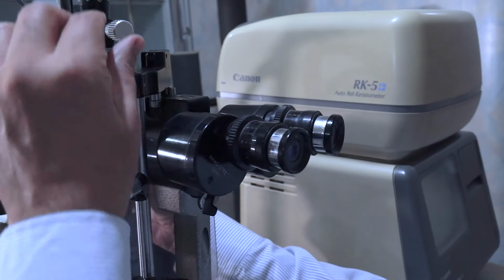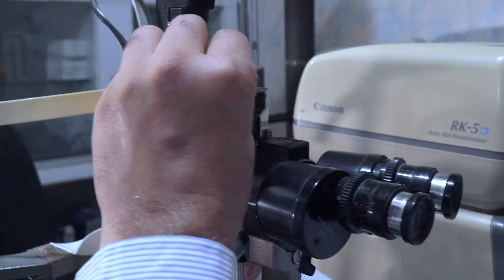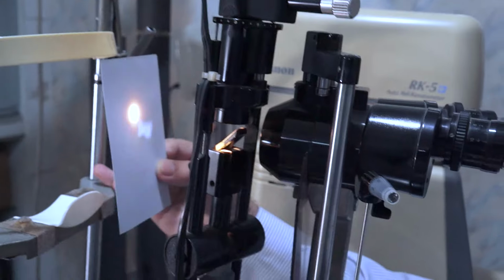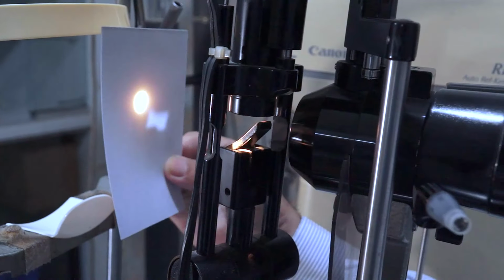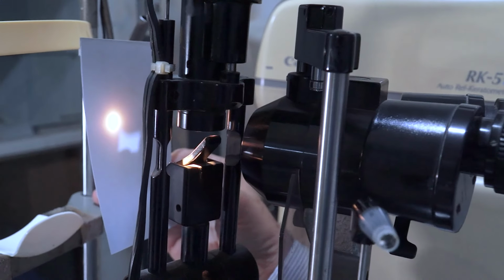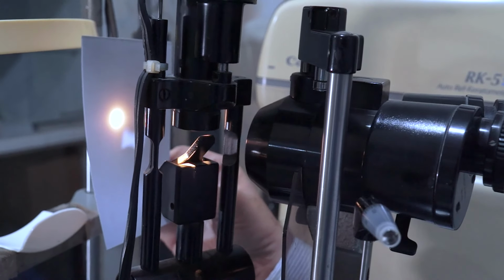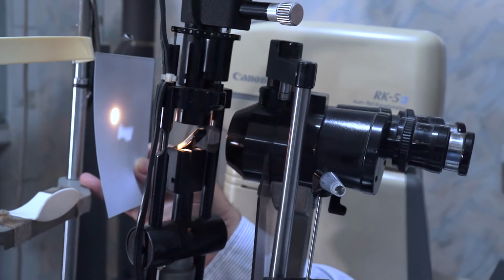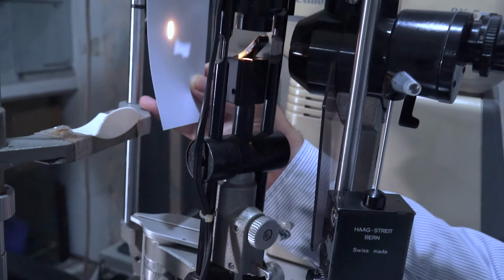This is called a slit lamp because this is the whole light of this one, and then we can change this round light into a slit to see more details of any abnormality, like we are doing here.